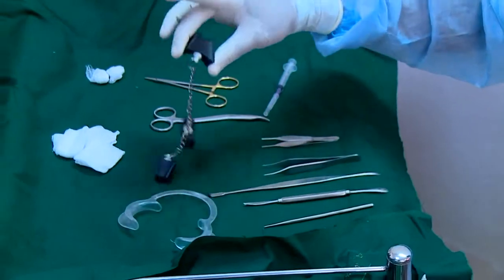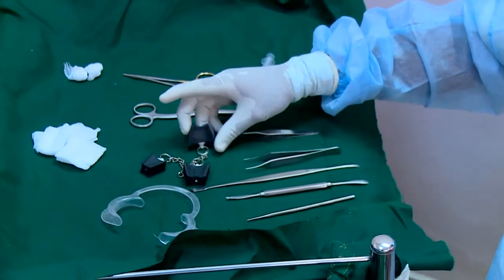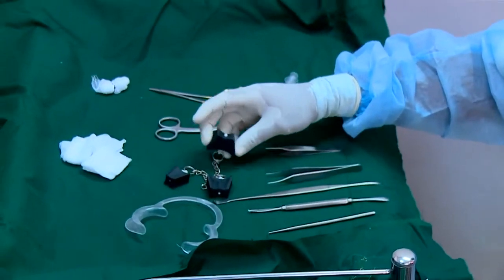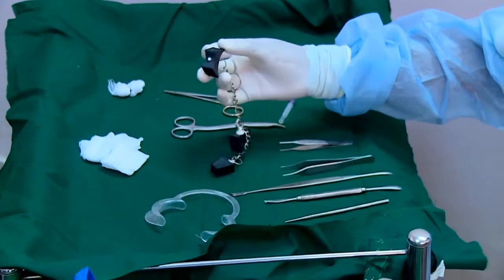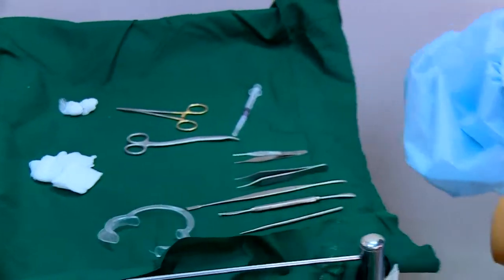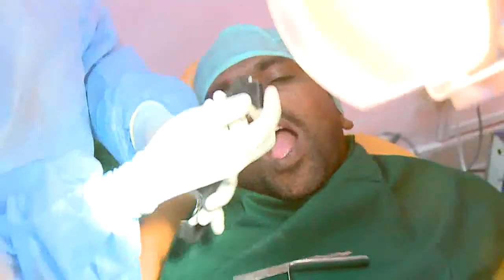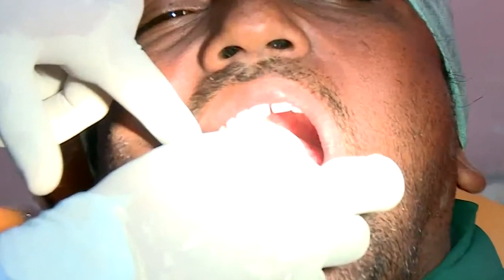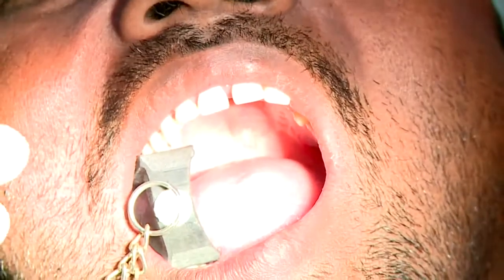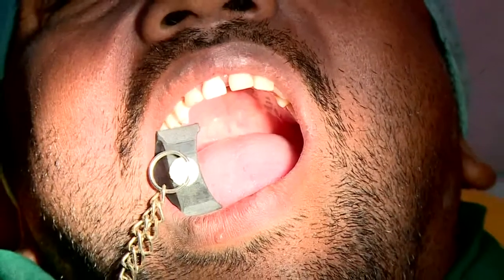Now, this is a fantastic one. I'm sure the interns would have seen it. Finally, you might not have seen it. This is what we call McKesson's mouth prop. I'm going to bring it back to the patient. Whenever we talk about implants, you can see that the patient can rest his mouth, but the mouth opening is still maintained. That's the most important thing.